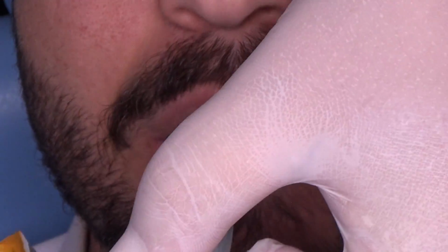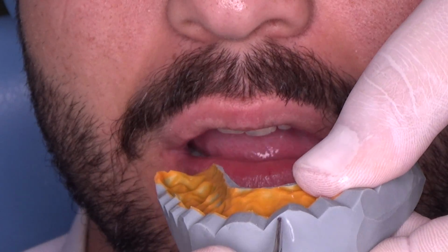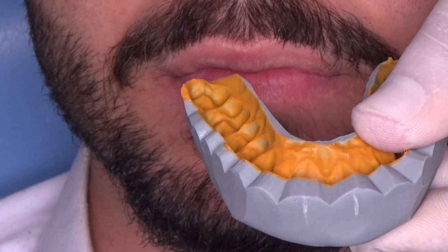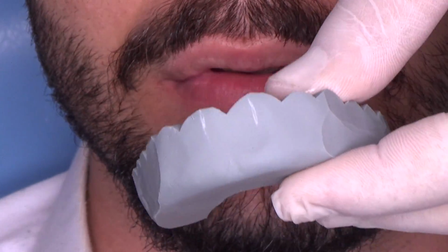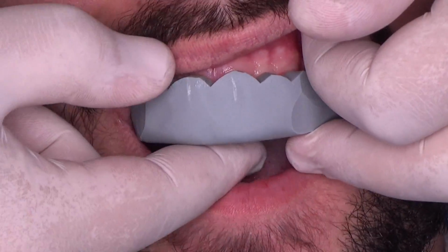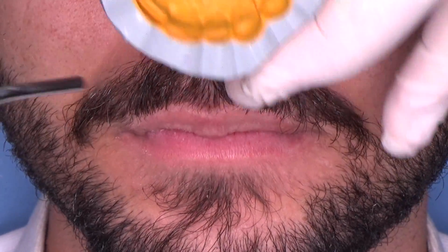Okay, thank you. It's good to mark where are your central incisors on the silicone, just with pen or with your instrument, doesn't matter, to know exactly how to position it. Otherwise, you can be lost and you will wonder where is the position. So you have to air dry a little bit.